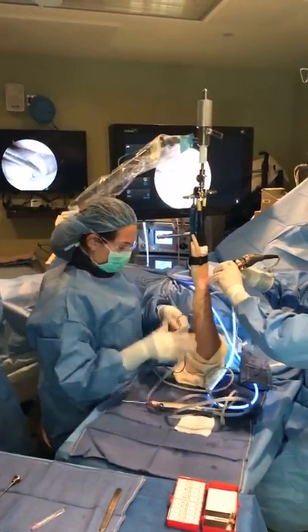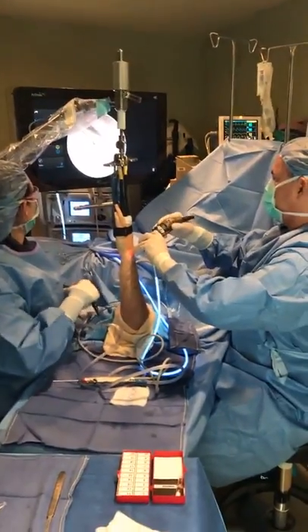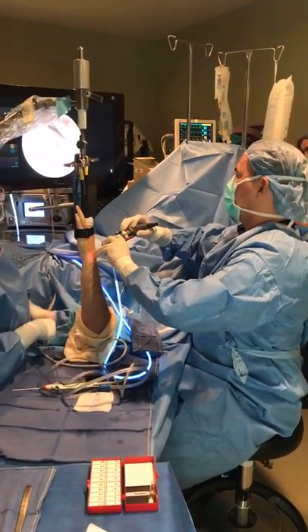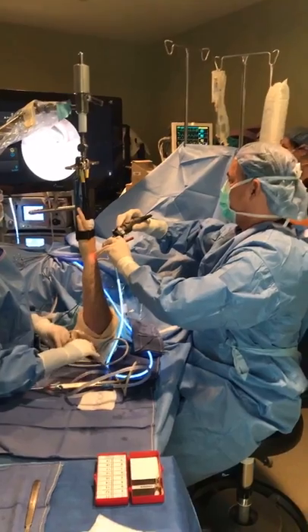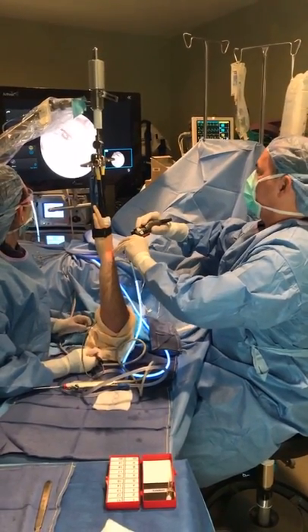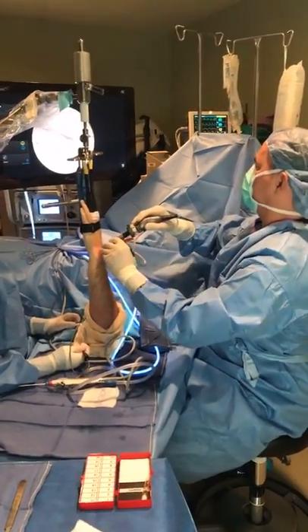Look, I can't even put the probe in. So my friend Will Geissler would say this is a Geissler stage zero. I can't even get the tip in. So that's a great sign. Normally, there's some motion here. And so he's got a very tight joint.